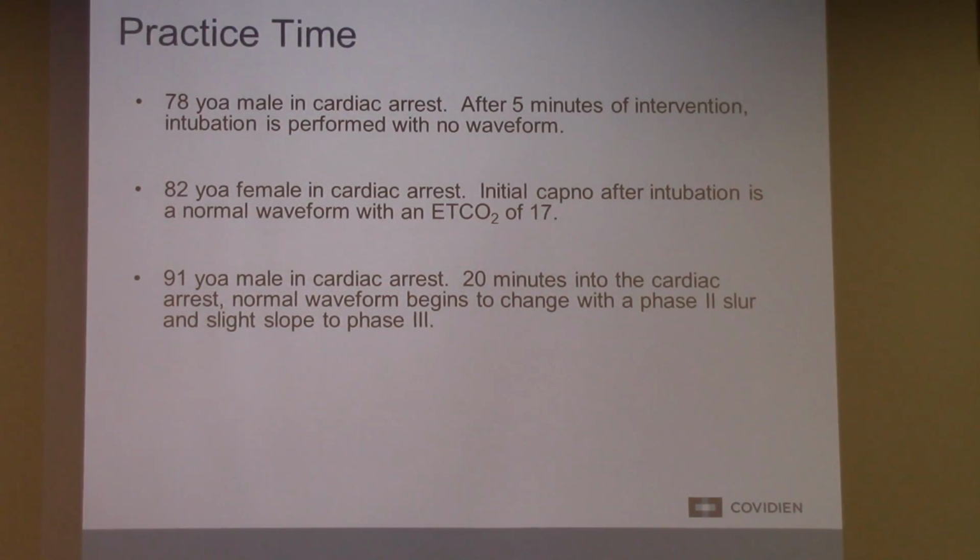Intubated patient, and you start to see a shark fin develop. What does a shark fin tell you? In a medical situation with a capnography cannula? What does it tell you on your tube? Suction your tube, exactly. Okay, it's a bronchospasm, but in the intubated patient it bottlenecks up secretions. Secretions can't usually cause it in the lungs with a cannula, but they can in the tube.